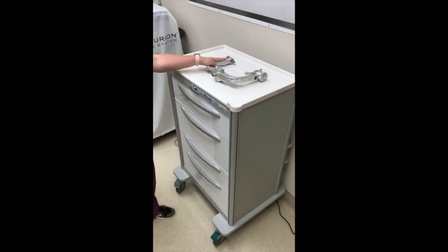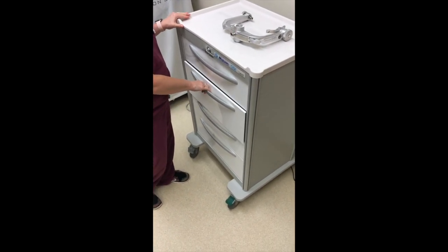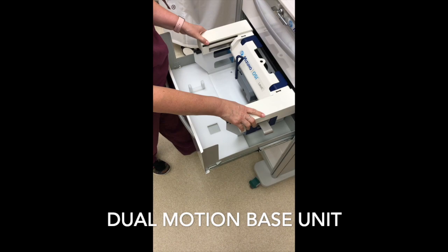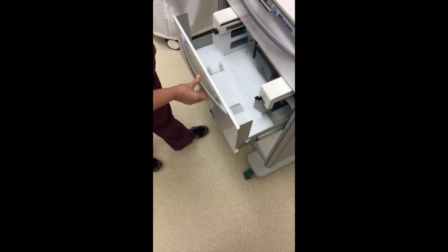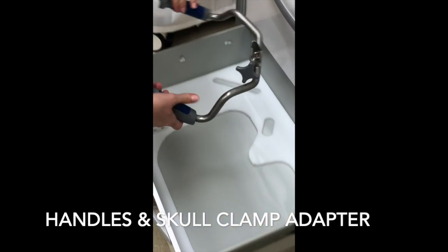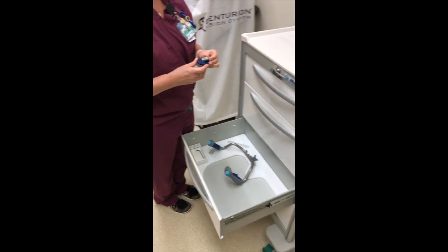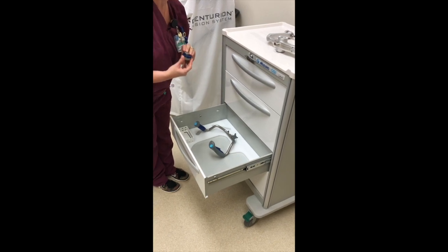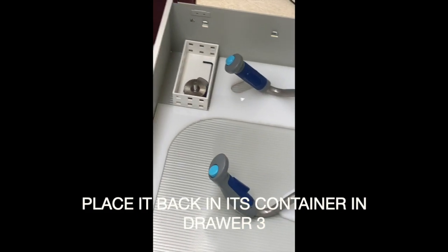You'll also need your Mayfield clamp to use the Laveau headrest. In the second drawer, you will find the dual motion base unit, which goes onto your table. In the third drawer, you will find the handles and the clamp adapter, which is compatible with the Mayfield headrest and the Doro headrest. When the adapter is not attached to the headrest, it must be placed in the little tray in drawer three of the cart.